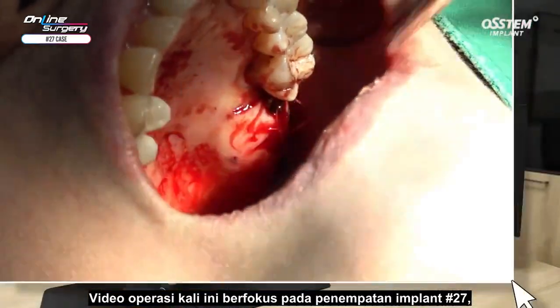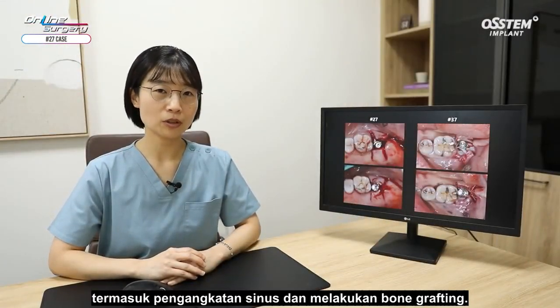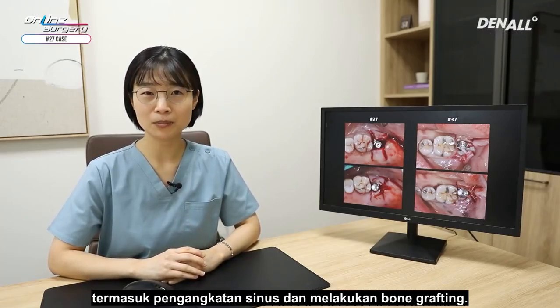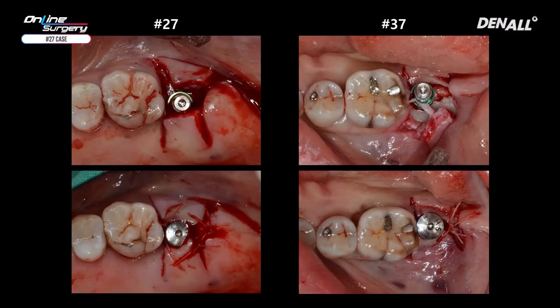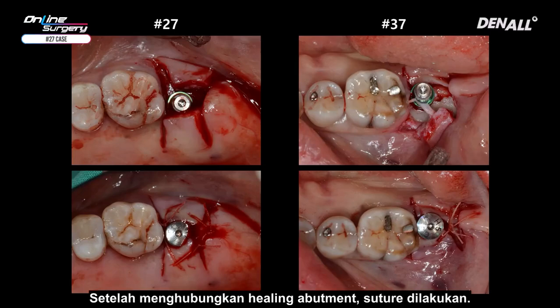Today's surgical video, which focused on placement for number 27, including its sinus lift and subsequent bone grafting, was shown. Let me share the clinical results with you. The implant was placed in the accurate position. After connecting the healing abutment, suturing was done.